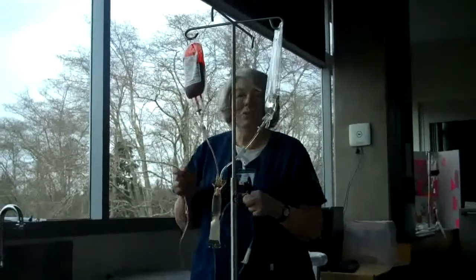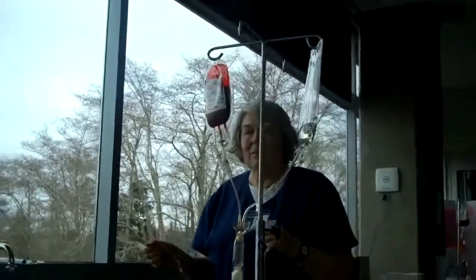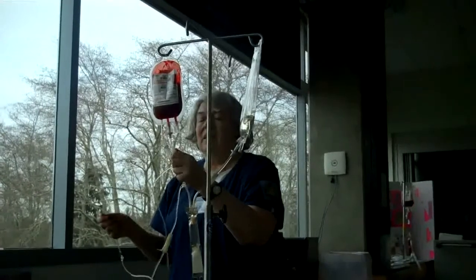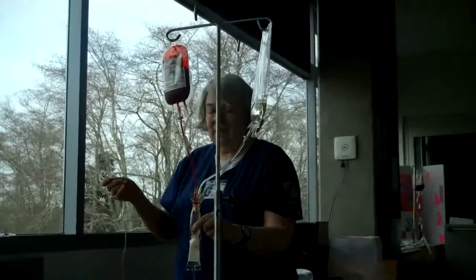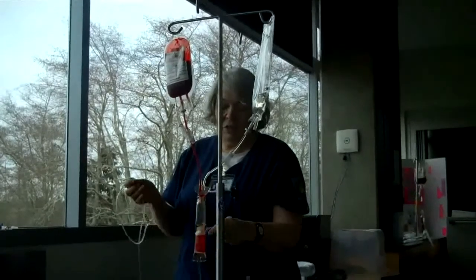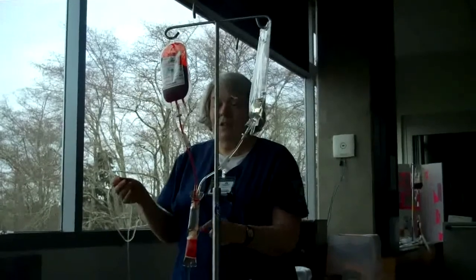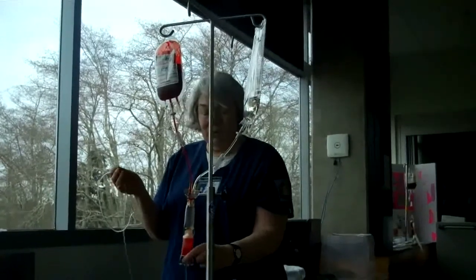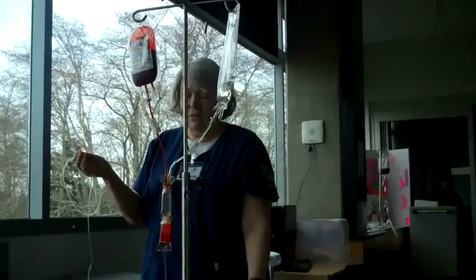I'm going to go to the patient, clean the patient's port, connect the port to the IV, open up the blood, and prime it down. At this point I would make sure that I've set it to go at 120 milliliters an hour, and I am ready to come back and check on the patient at 5 minutes, 10 minutes, and 15 minutes to make sure the patient is fine.